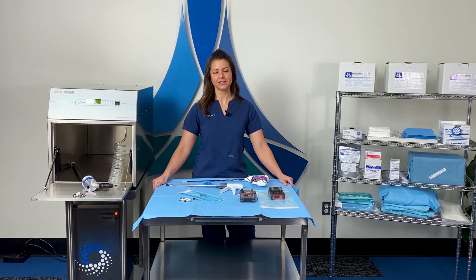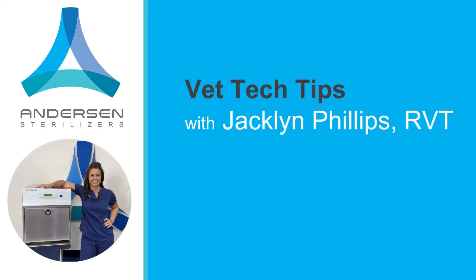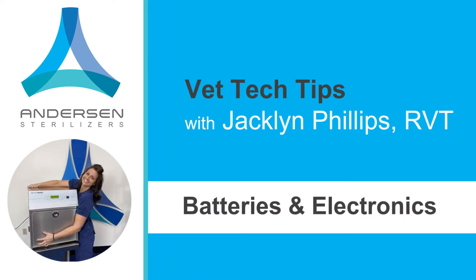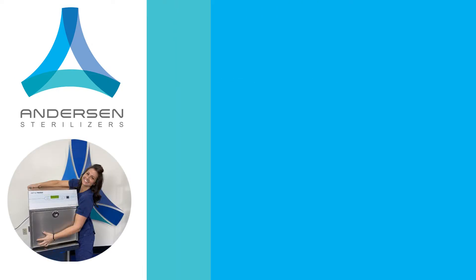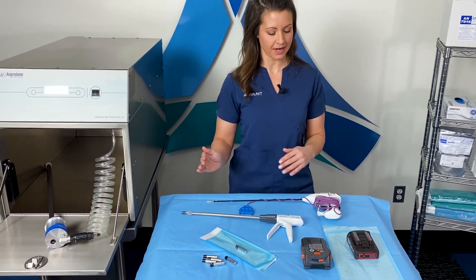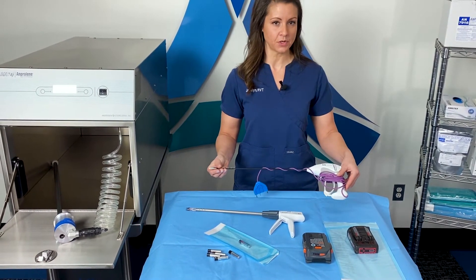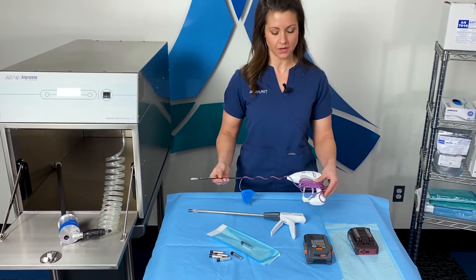Today's tech tip is about sterilizing electronics and batteries in your Eogas sterilizer. All of these things on the table are compatible with Eogas. The electronics are great for this because there's no damage to this instrument while it goes through the cycle.